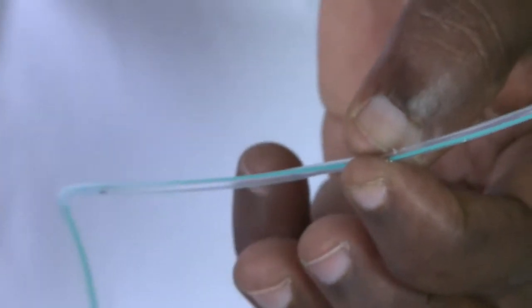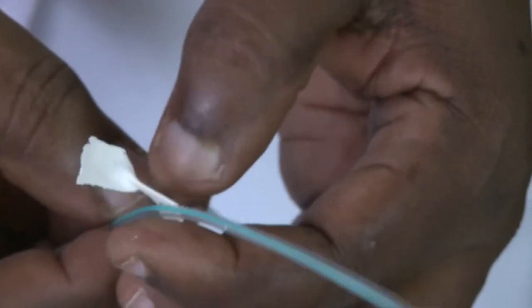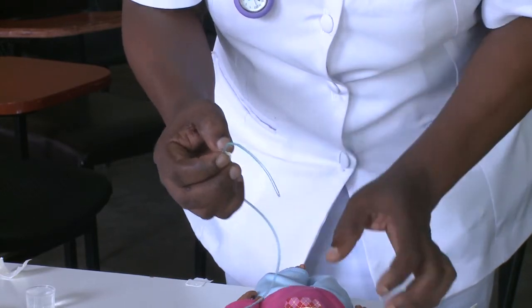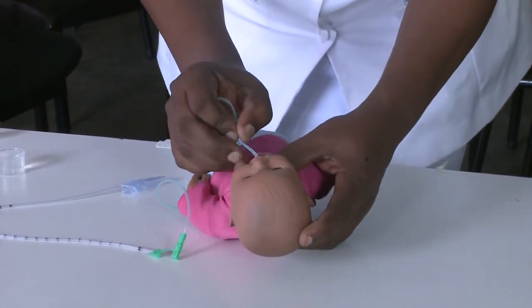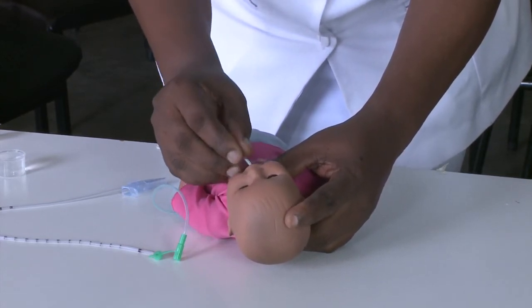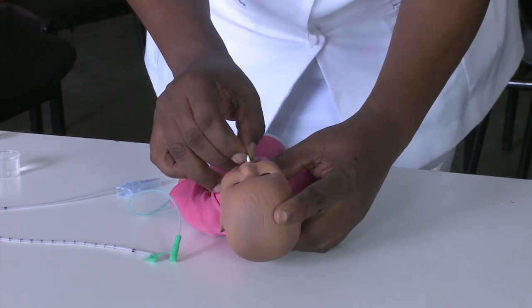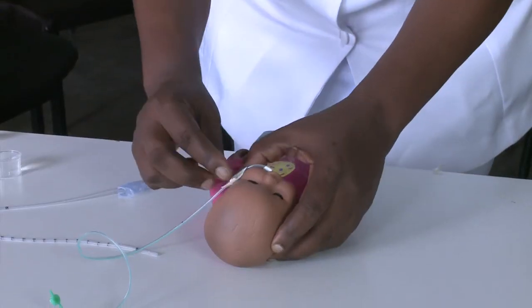I'll use a very small tape to mark the length. This is just to remind me of the length of the tube that I want to insert in the baby. So I will insert it in the mouth because the nose is going to be plugged with the prongs. I've inserted it up to the length that I needed. Then I'll put a tape to hold the OGT. This is my tape to hold the OGT for the baby.